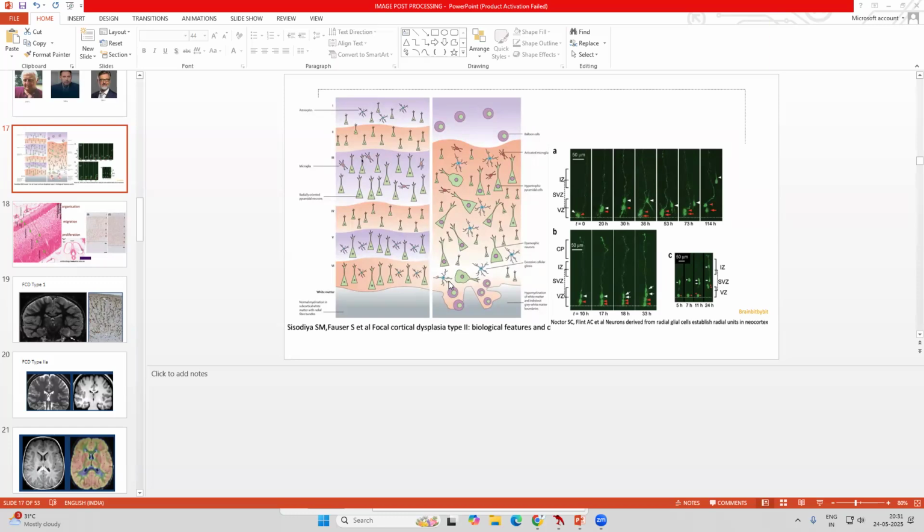Cortical dysplasia, MRI is certainly much better than FDG PET, because that can be a very thin sliver of dysplasia. Our PET resolution is not so good, so we'll have a partial volume or finite resolution effect, and it will not appear hot at all. So MRI is a better way to look for cortical dysplasia. FDG PET is mostly for mesial sclerosis.